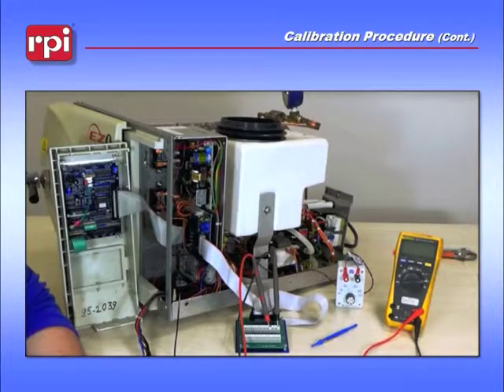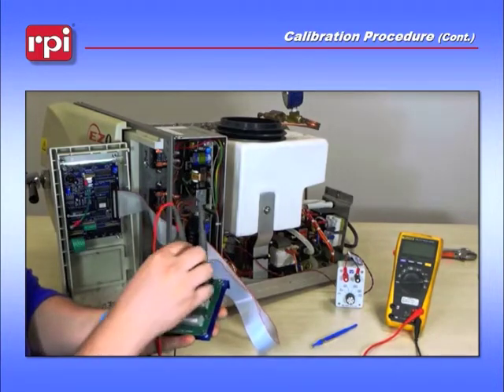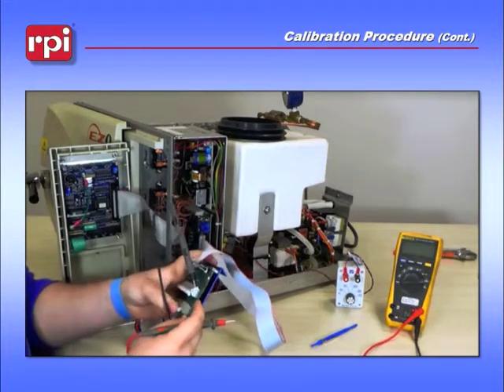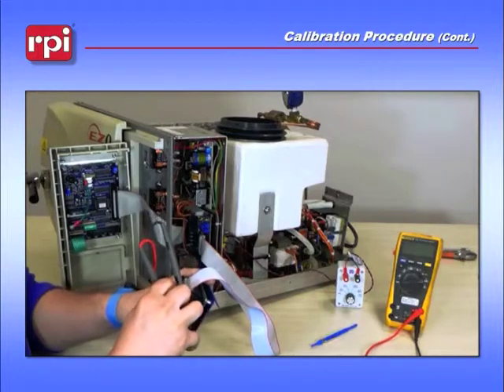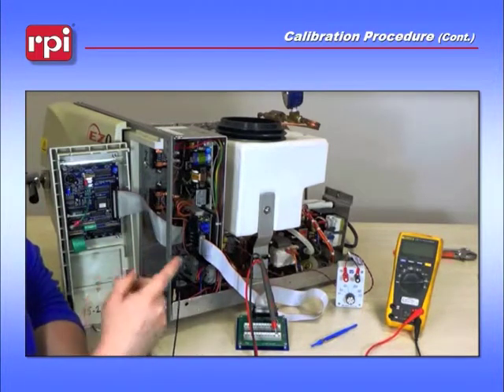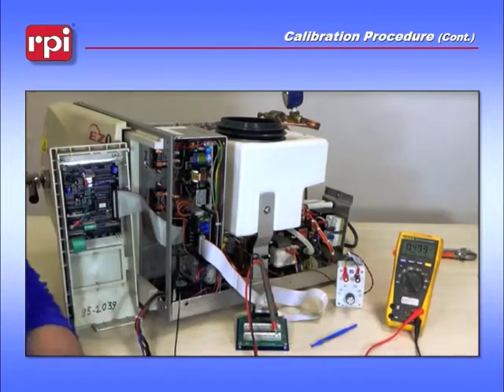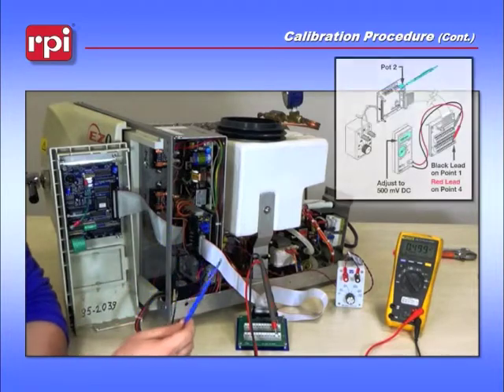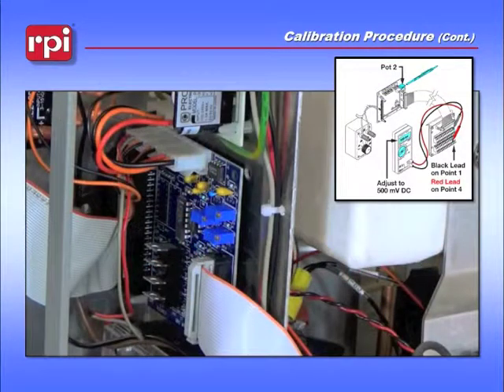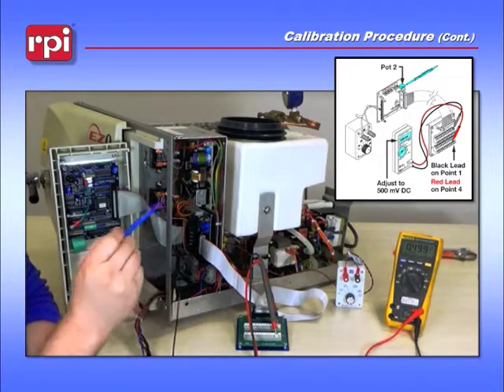The last part of the calibration procedure is to take the TUB-109 and move only your red lead from test point 7 to test point 4. Turn your multimeter to either the millivolt DC scale or the volt DC scale, depending on your meter — but you'll need to see at least three decimal places if on the volt DC scale. Grab your RPT-460 again and adjust pot 2. You need to adjust it to 500 millivolts, or 0.500 if you are on the volt DC scale.